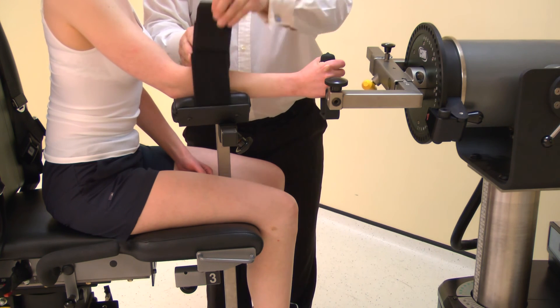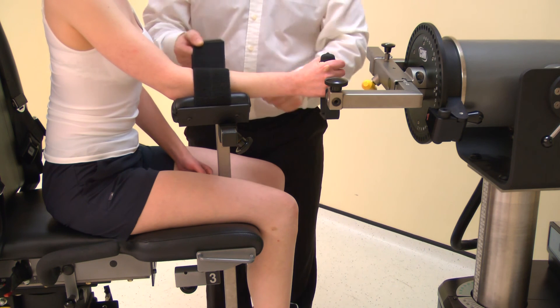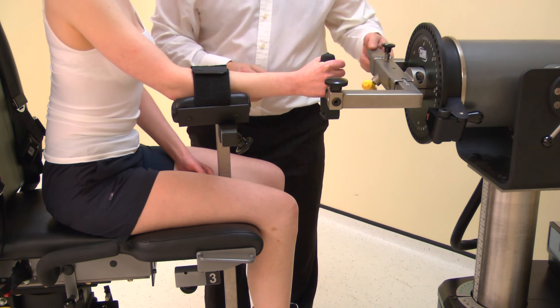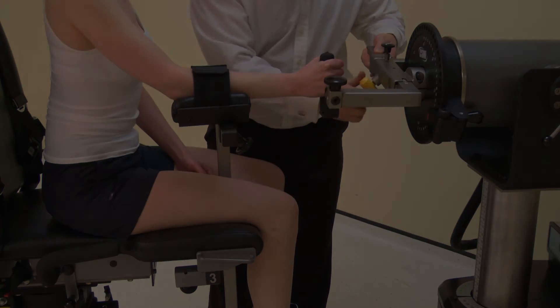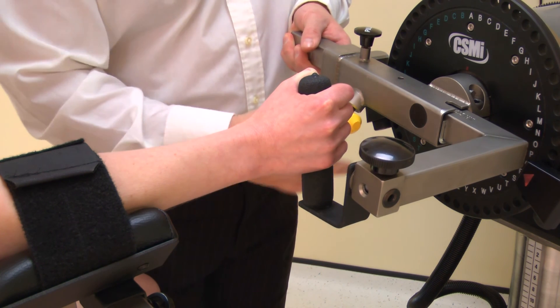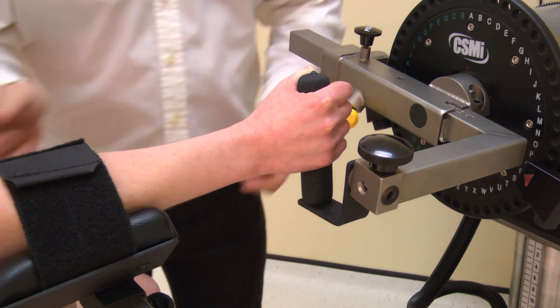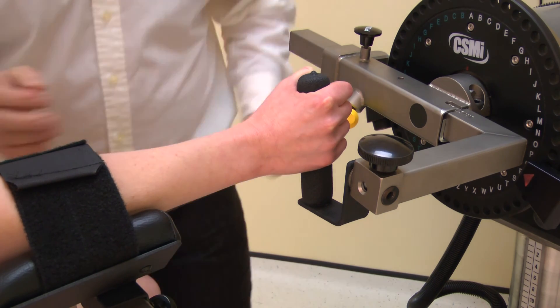Attach the forearm strap. Now adjust the length of the wrist shoulder adapter to ensure the center of the forearm is aligned with the black dot on the input adapter. The axis of rotation is through the center of the forearm at the fourth finger level. Adjust the lateral position of the forearm stabilizer to ensure there is no torsion in the forearm.